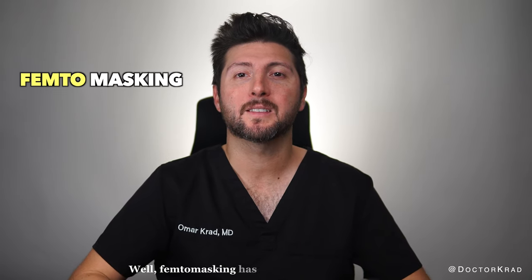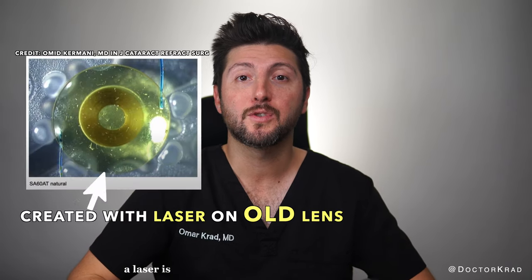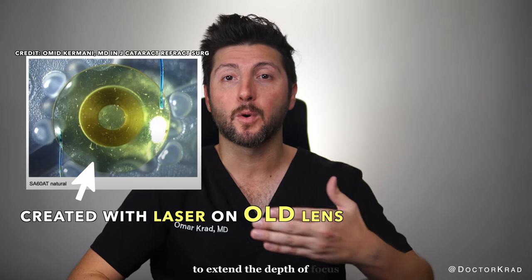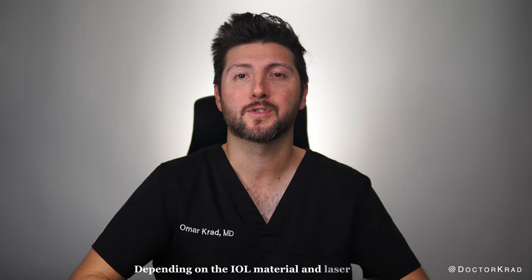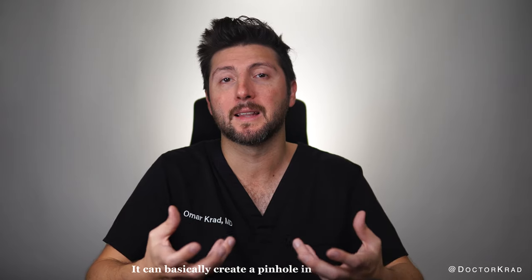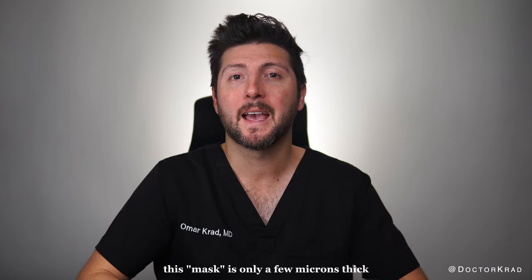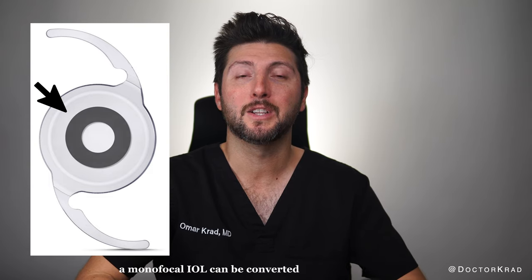Femtomasking has the potential to do just that with previously installed lens implants. A laser is used to generate a small aperture or pinhole to extend the depth of focus and reduce optical aberrations. Depending on the IOL material and laser settings, the laser can create soft opacification to black carbonization. It can basically create a pinhole in the lens implant you currently have without surgery. This mask is only a few microns thick and takes about two minutes to create. With this technique, a monofocal IOL can be converted into a small aperture presbyopia correcting IOL.